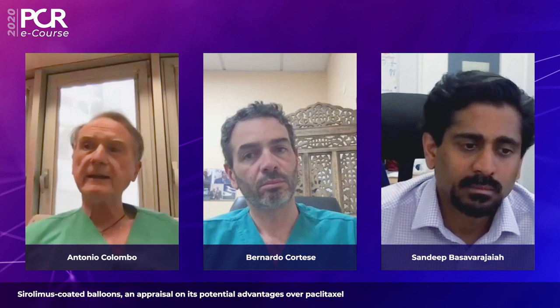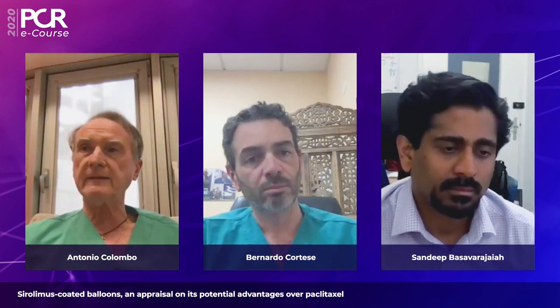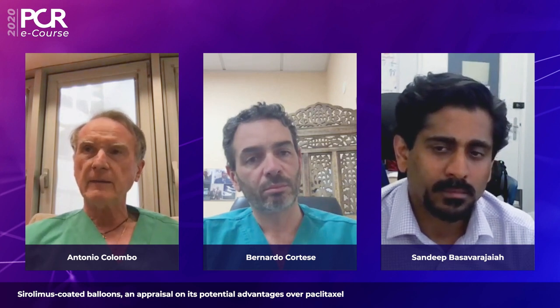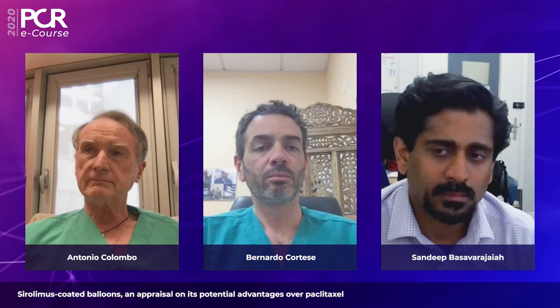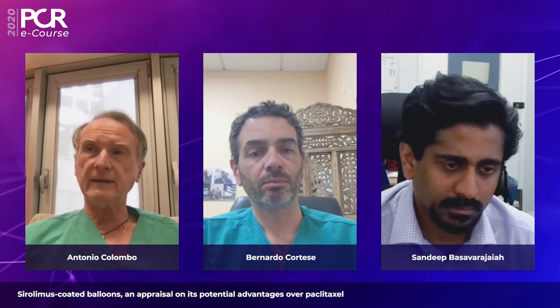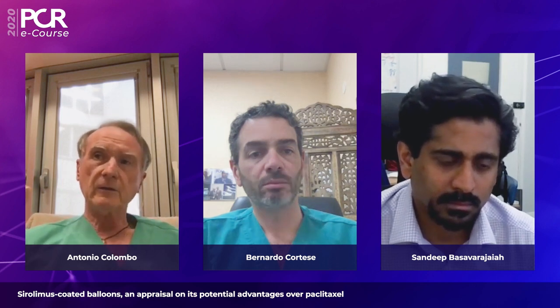Of course, you have to be willing to do an immediate crossover of about 20%, because in some cases you will have a dissection that you don't want to leave as it is. But accepting an immediate crossover of 20 to 30%, you can avoid long stent in a number of lesions with all the benefit we know, including the positive remodeling that you showed pretty convincingly.